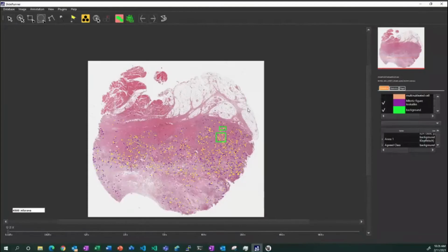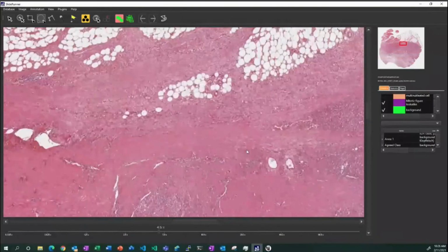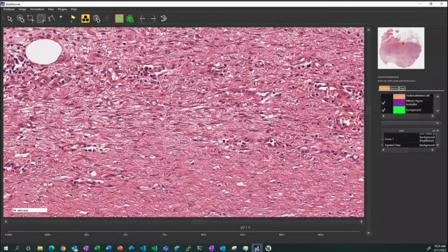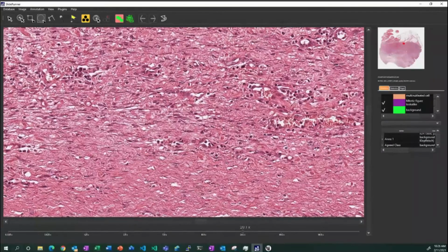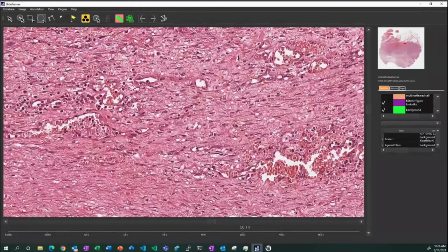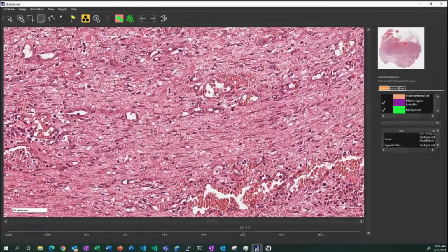Like he knows these white sections here at the top aren't likely to have that. So he already knows where to start looking, and then he is scanning, typically at full magnification, across that image. And if he sees an area that he thinks has more activity, he'll focus on counting it there.